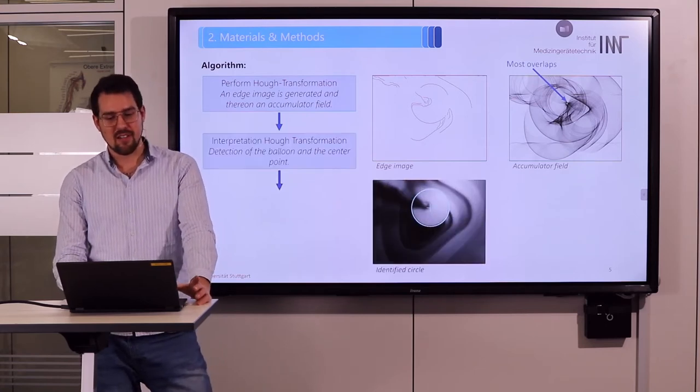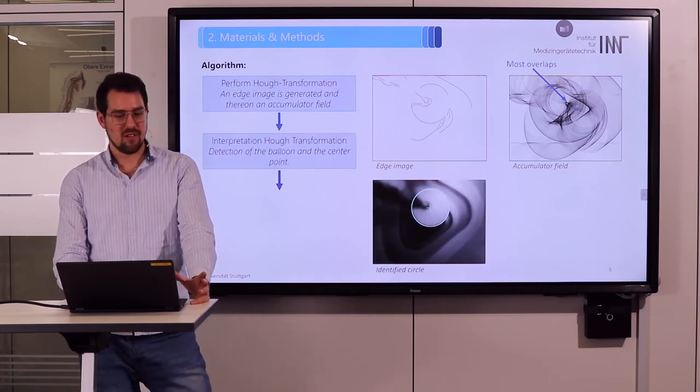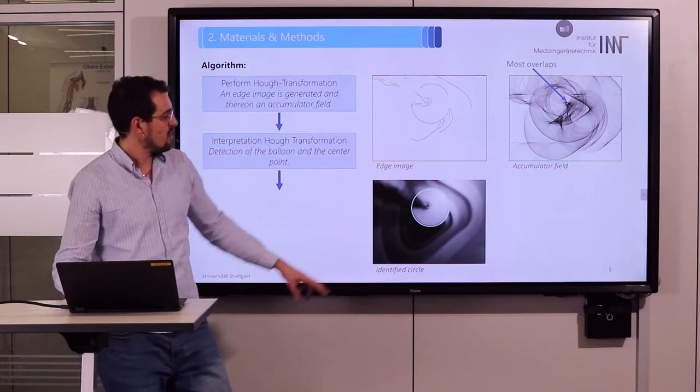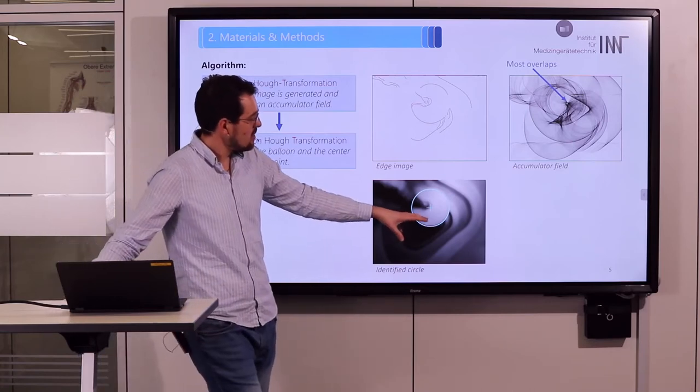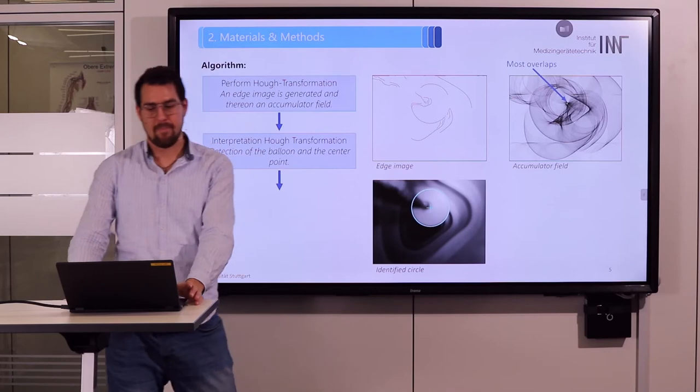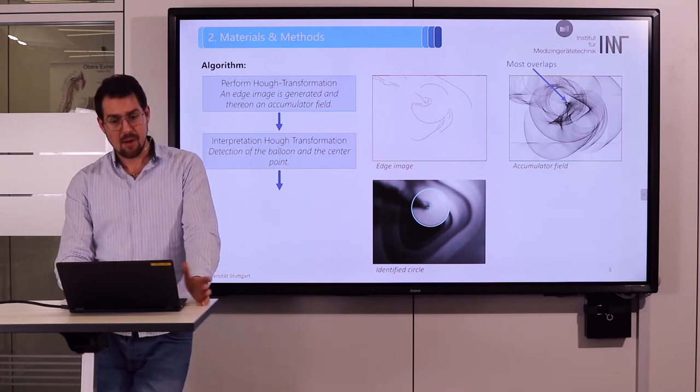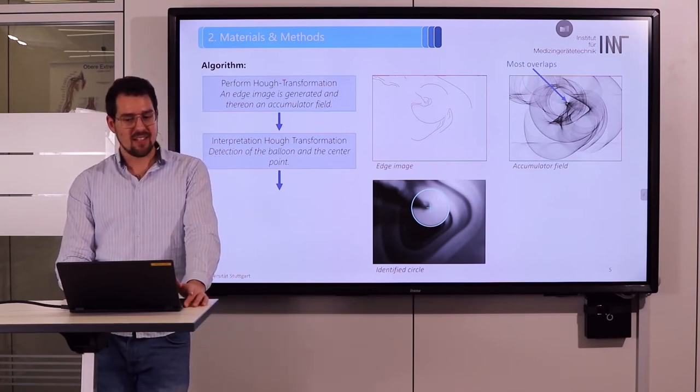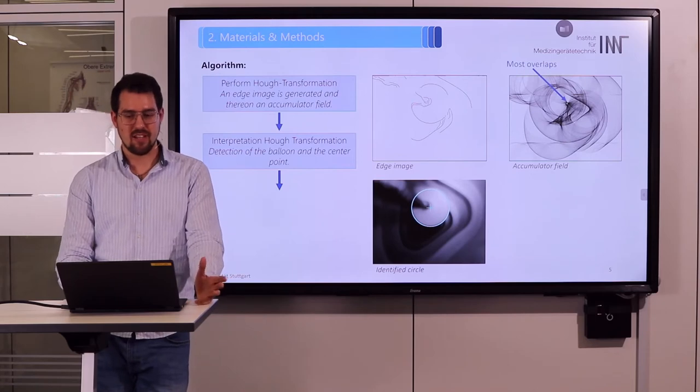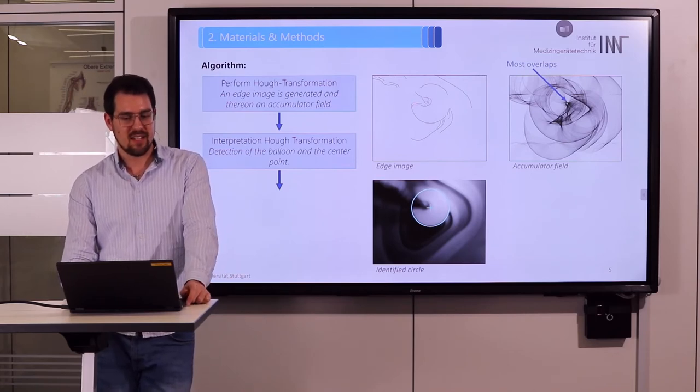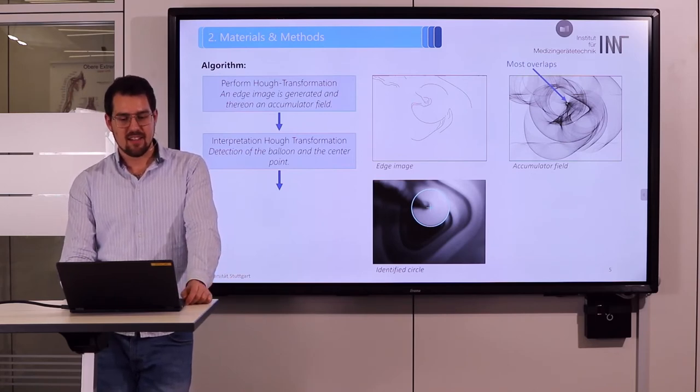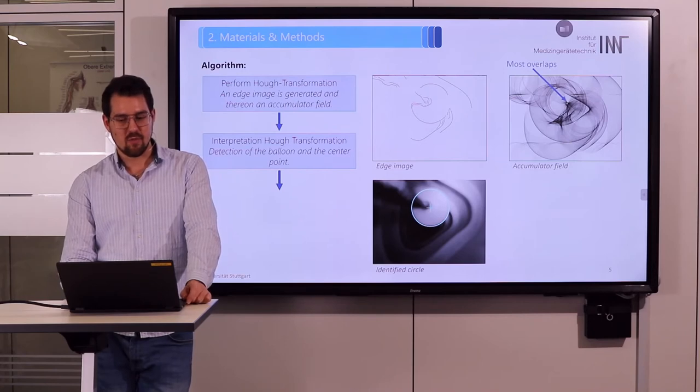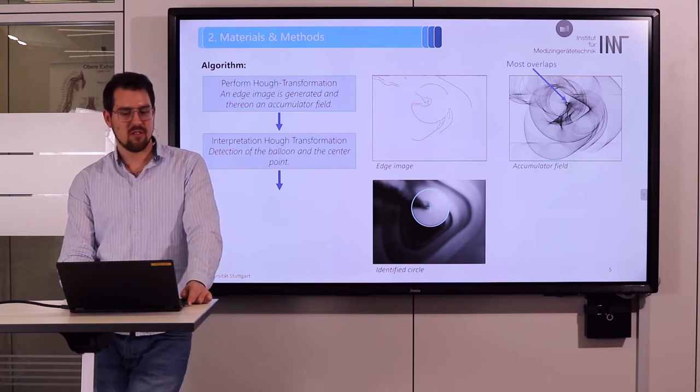Now that we know where the center of the circle is, we can draw it in our image. You can see the circle is actually our balloon. Moreover, you can calculate the deviation to a certain point. The calculated vector indicates the direction in which the endoscope must move to follow the contour of the intestine.